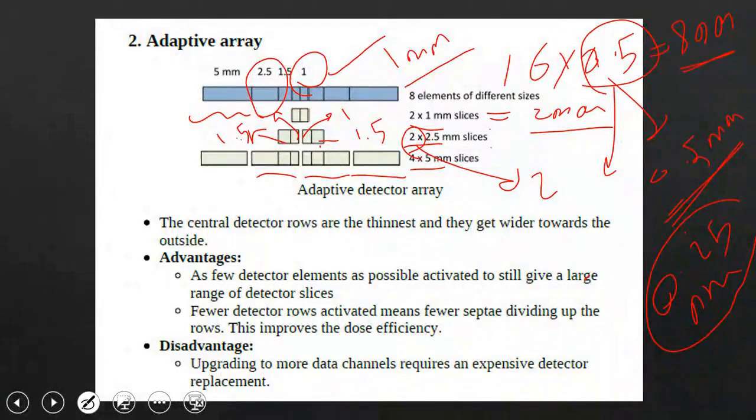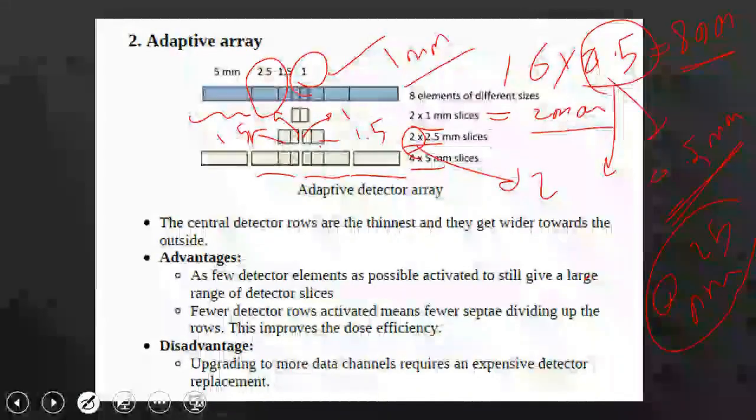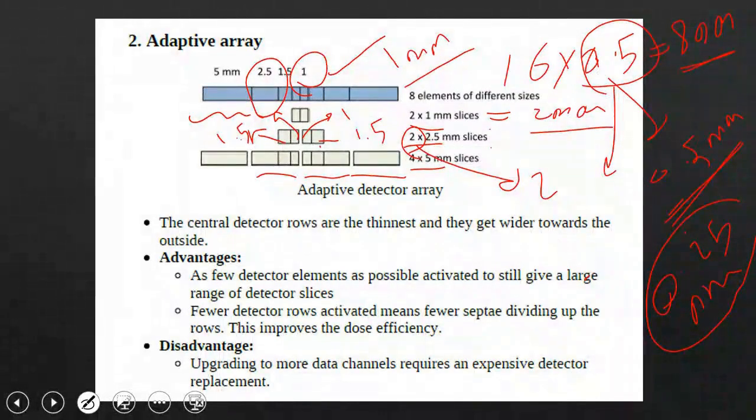So, can I work today with 2.5 millimeters? Or can I work with 1.5 millimeters? The choice of millimeter size can significantly impact the precision and effectiveness of the detection process.